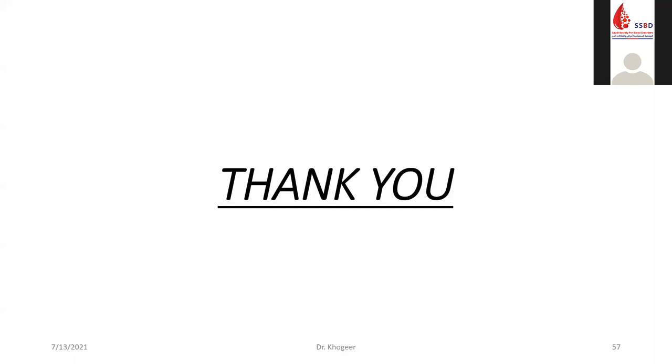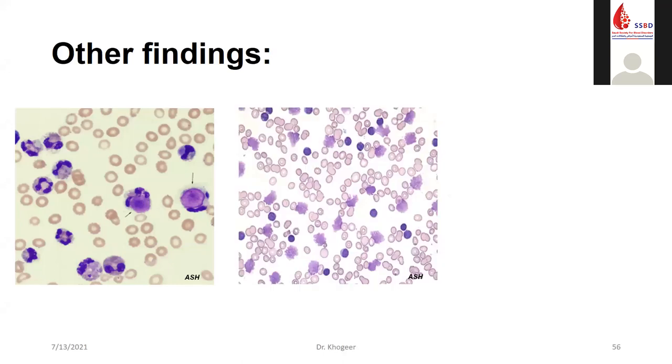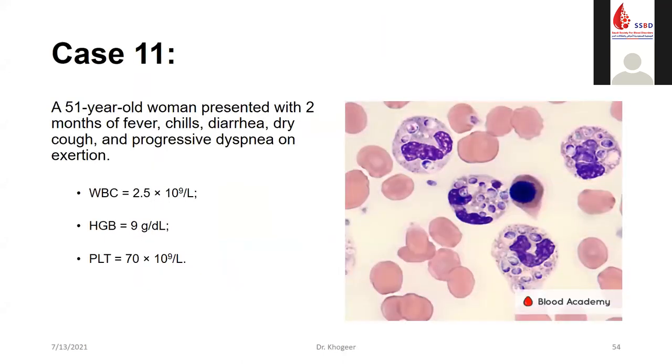Yeah, can you show more slides regarding leishmania? The important thing regarding leishmania is that it has extracellular and intracellular inclusions, and it's smaller than the other inclusions. When we compare it, for example, to histoplasma, see, histoplasma has large, round, dark inclusions. This is why it's called capsulatum.